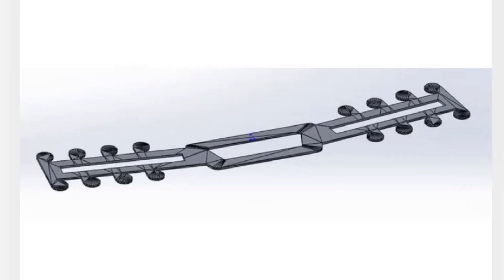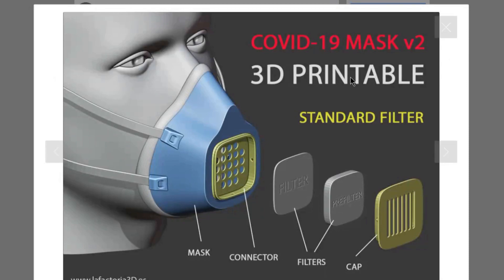Next, you're going to have to print a surgical mask strap — these two go together. For the COVID-19 mask, you can use a standard filter, which uses the mask connector, two filters — filter and pre-filter — and the cap.